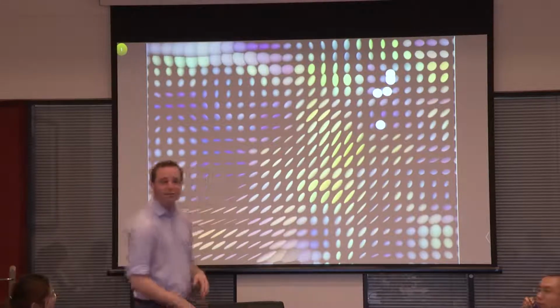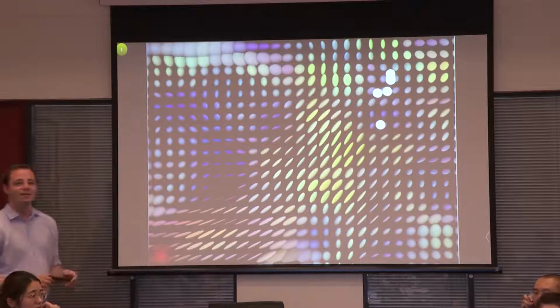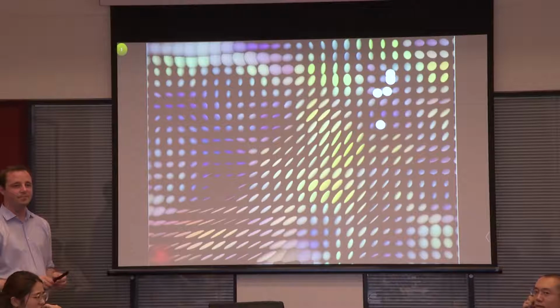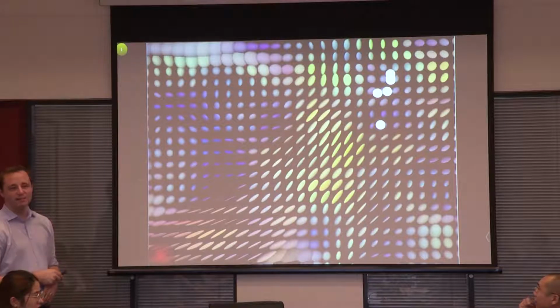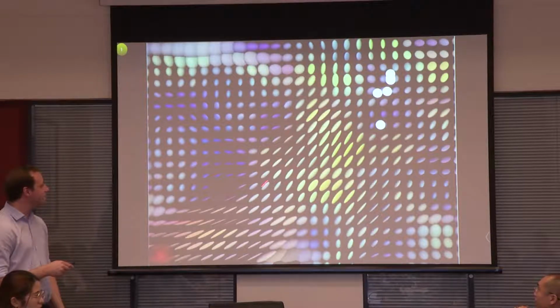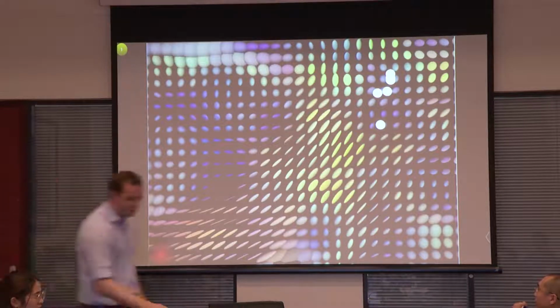May I ask a question here? Sure. For the tractography, one point I never understood before, probability like this, how do you decide whether water is flowing in this direction or this direction? Yeah, so basically what you do is to add noise to the data. That's simple. You don't always take the main direction, but you add noise. I have a slide of that.